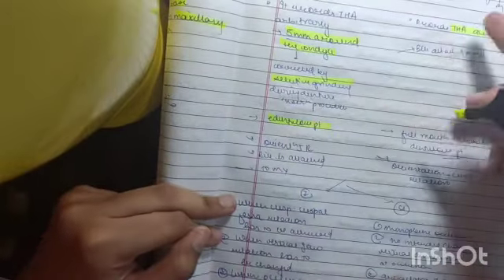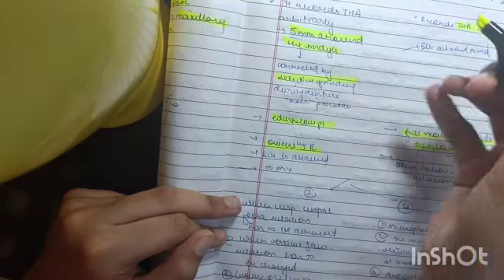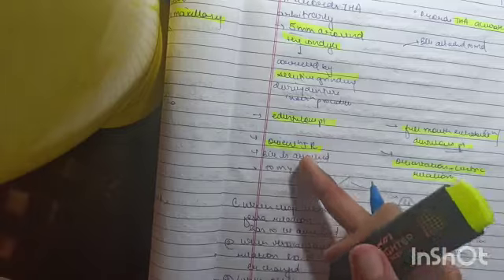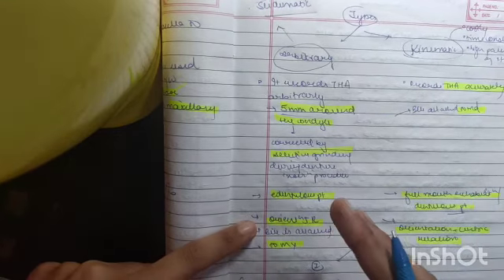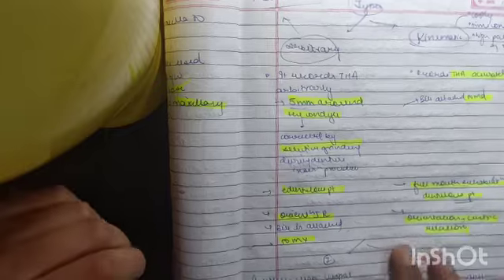Arbitrary is used for edentulous patients, and for full mouth rehabilitation in dentulous patients, we use kinematic. Orientation jaw relation is derived from arbitrary orientation as well as the central relation from the kinematic. Then the bite fork is attached to the maxilla in the arbitrary and to the mandible in the kinematic. Now, important to remember here is that we use arbitrary type of face bow for usual records, and we do not use kinematic face bow record.